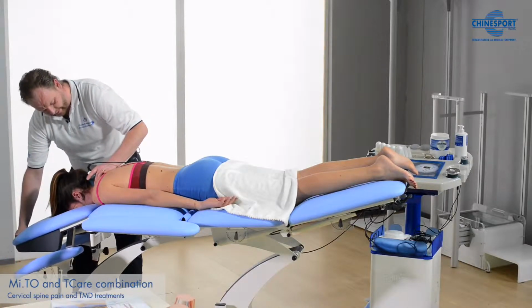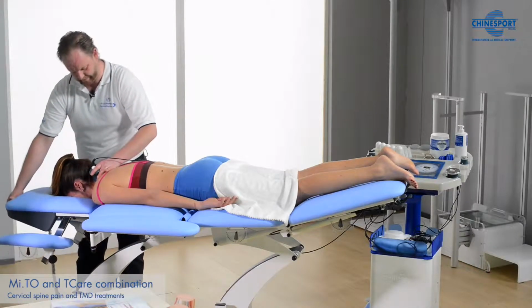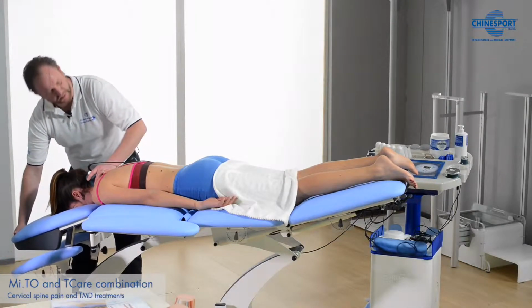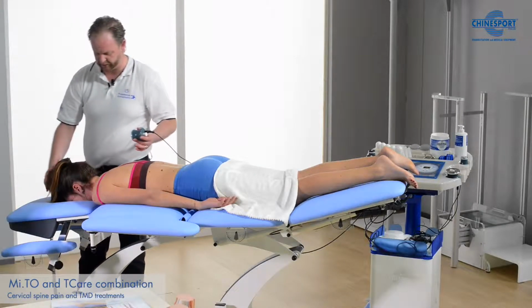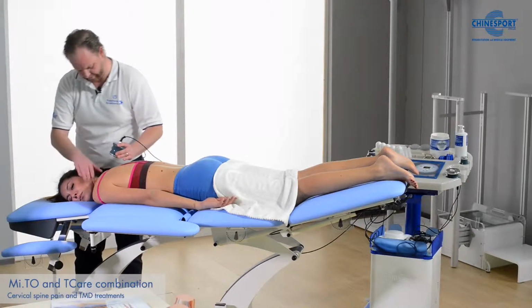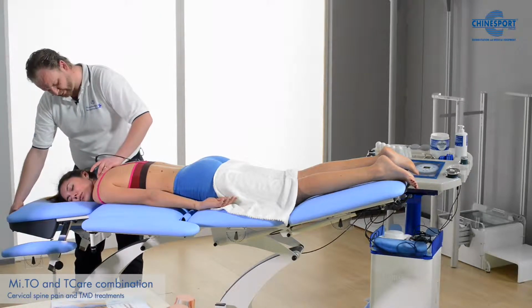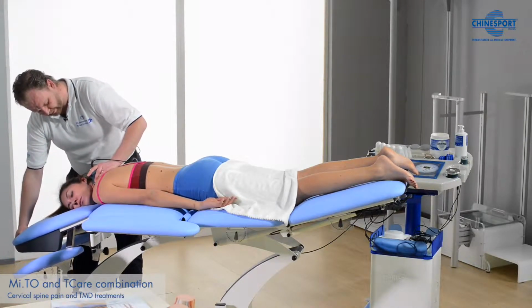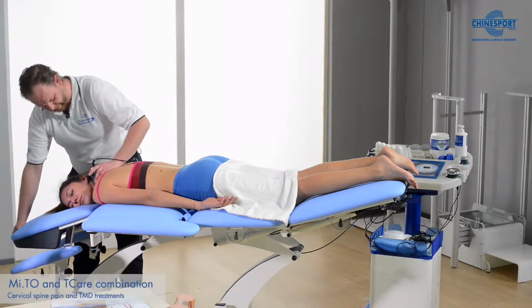By simply moving the head section. If we want to add some rotation, we can ask our patient to look maybe towards left or right. We place it here, can move a little bit, and we can work here. It's very nice and gentle movements, very smooth movements that we can make.